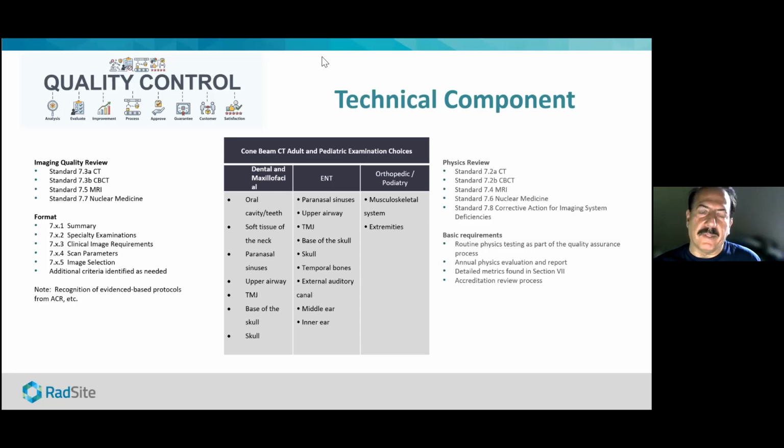I believe that CT, when done responsibly with cone beam CT, really is as safe or likely safer than conventional X-rays that are used in dental practices, often with lower radiation doses and with much greater information and detail associated with it. But the best way for any individual practice to be able to test that they are doing high quality safely is to go through that accreditation process and to educate patients about how important that is.